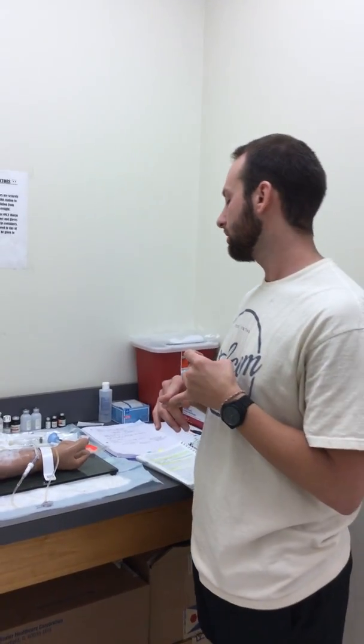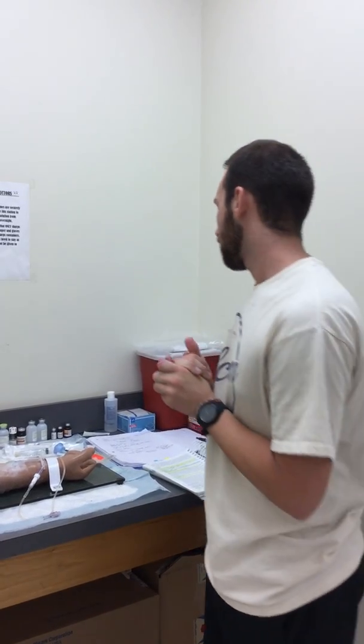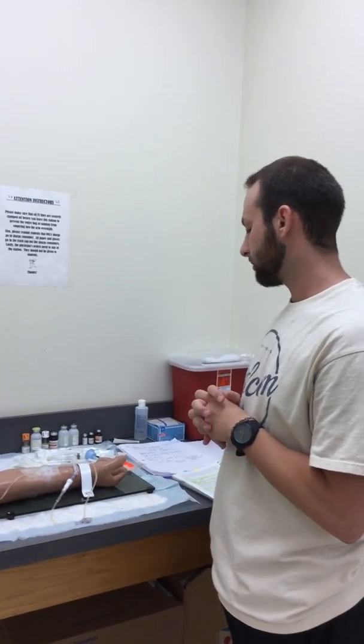And we're going to get in there. We use our 2 identifiers with our patient. We're going to want to check the name and date of birth compared to our MAR, and then we're going to ask the patient if they have any allergies, and make sure that nothing is interfering with the meds. Then we're going to wash our hands and put on some gloves before we give it. We're going to want to make sure that the meds are correct for the right patient.